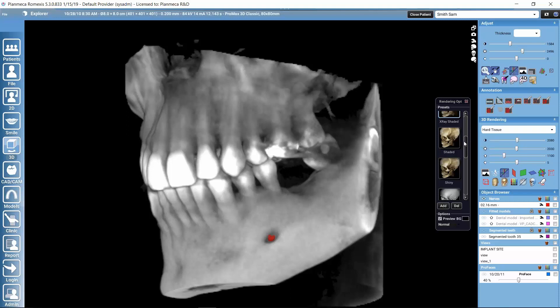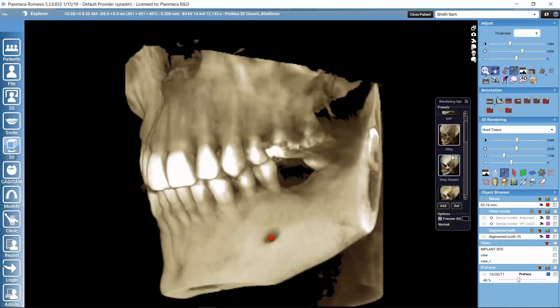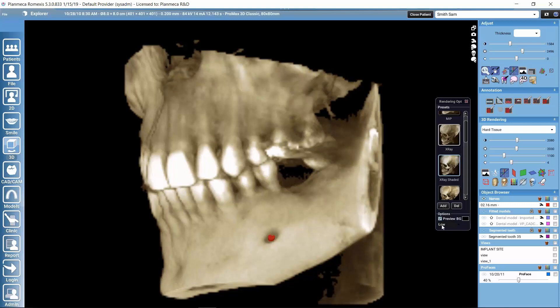In this settings dialog there is also the option to change the resolution of the rendered view. Clicking on 'Normal' opens a dropdown with different resolution options — you can select low resolution, or very high for nicer images, though higher resolution requires more processing power.